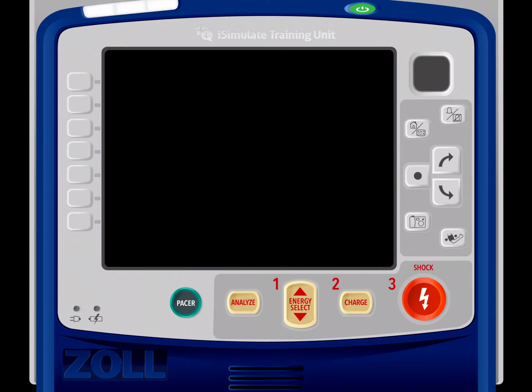So again, there's several different cardiac monitors out there. Hopefully by this point you practiced with all the different ones. You practice with the Zoll, with the Philips, with the LifePak, and are able to do things like defibrillate, pace, synchronized cardiovert, adjust the screen, run a 12 lead, adjust the leads you're looking at, all those kind of things you need to be able to do on the cardiac monitor for the dynamic station.